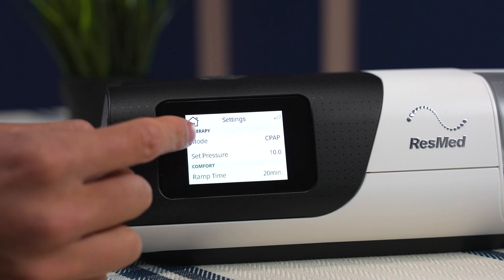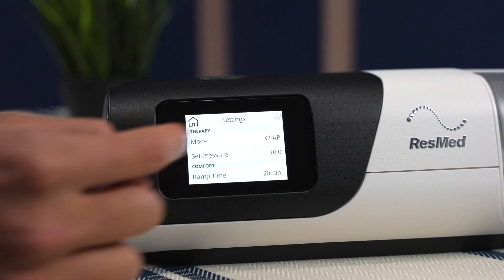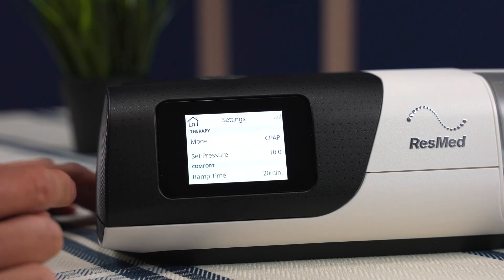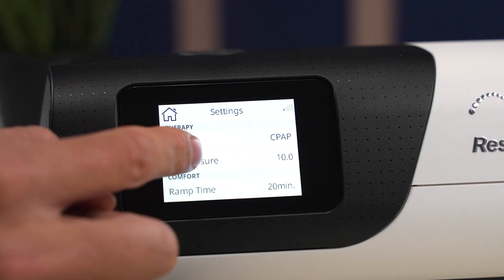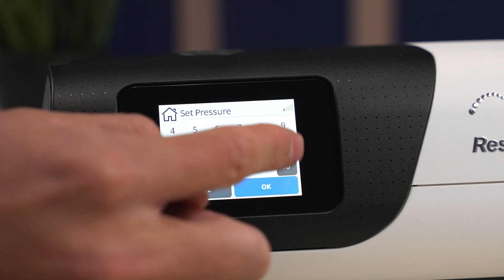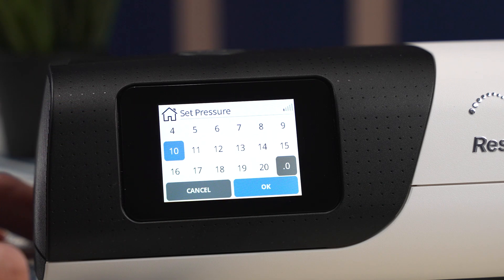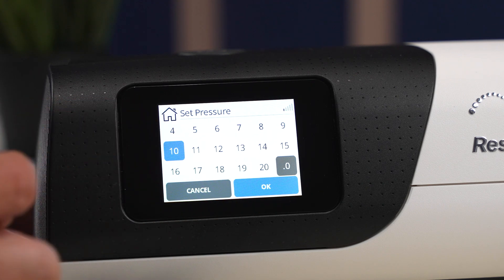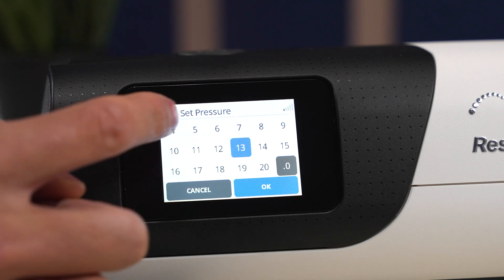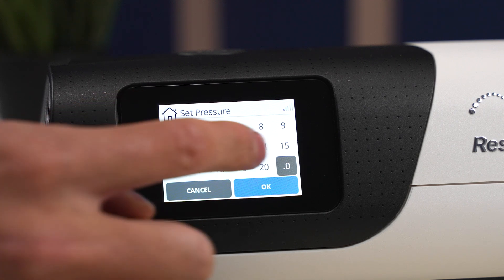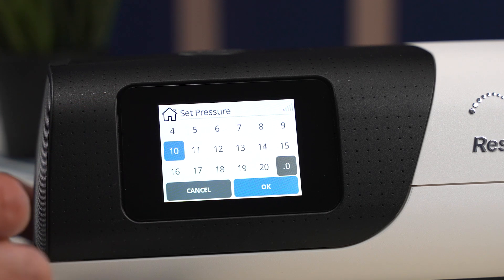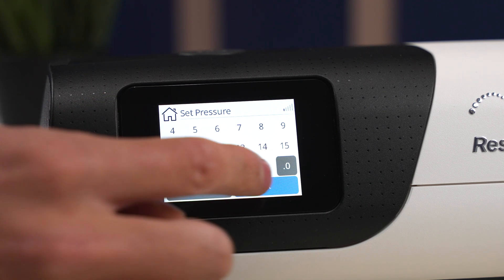We can see the mode is at CPAP mode and the set pressure is just right there. We're just going to click set pressure and we have all the pressures that we can change to. Right now it's set to a 10. We can change to a 13, a 4, a 20, and so on. Once you're done, click OK.